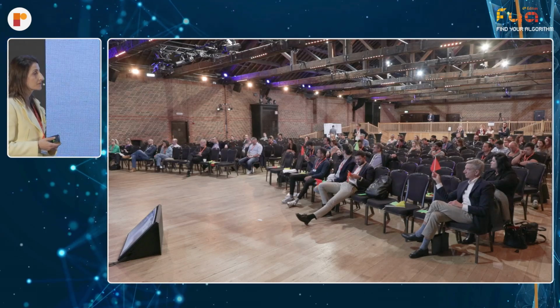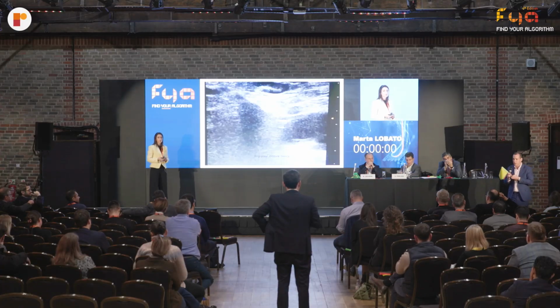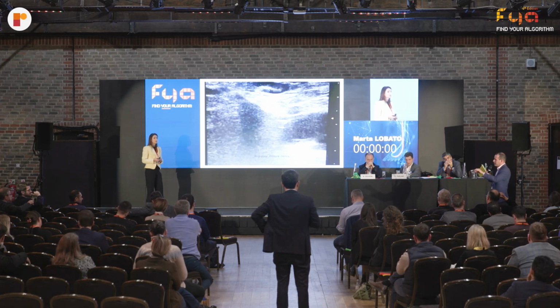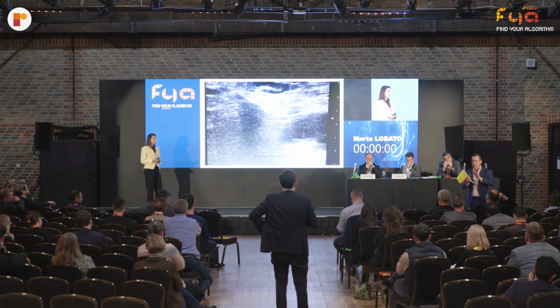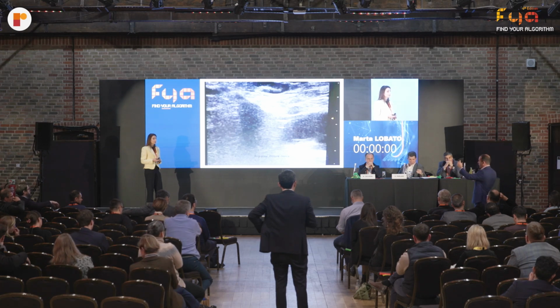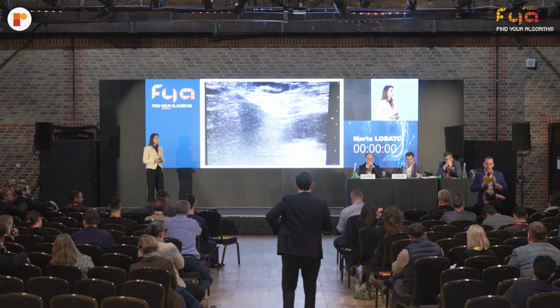And then guys, this is, I think, to me, very important. You have a Rutherford 6 patient, extreme conditions, and you're getting a little blush at the level of the first toe. For me, I would have no doubt. Short occlusion at the level of the tarsal artery, very easy to cross. What do you think?